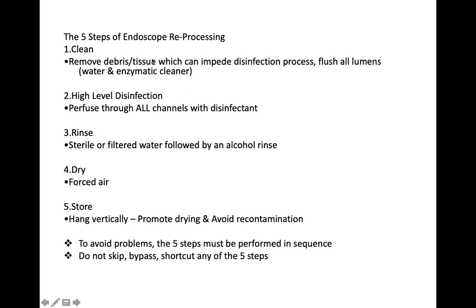This was just a small example to highlight, now bringing all this information together, the disinfection and sterilization processes. When we are in the hospital, you as doctors are using different gadgets, for example an endoscope. This can be reusable, used from one patient to another. So between the two patients, you need to take it through the process of disinfection or sterilization, depending on the Spalding classification, which we have looked at.